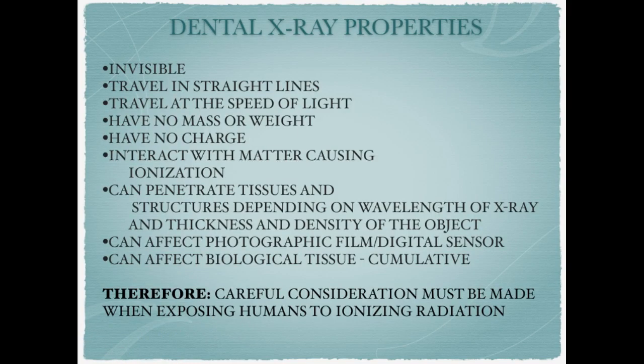Let's look at some properties of dental X-rays. They're invisible, so that when we are exposing an image on a film or a sensor, we don't see anything coming out of the X-ray tube housing or the PID. They're invisible. X-rays travel in straight lines.